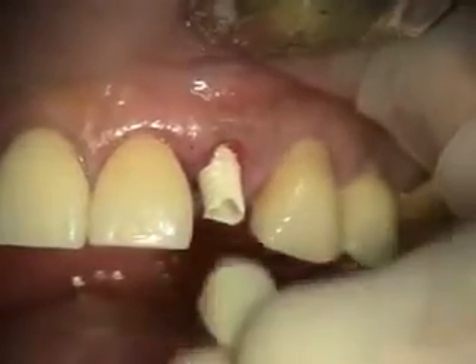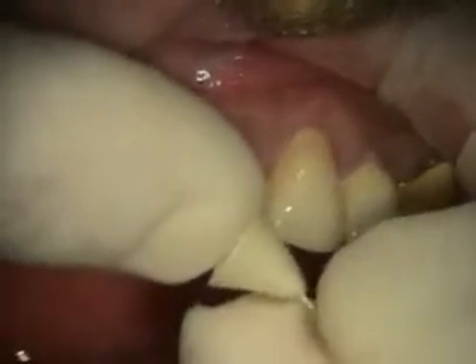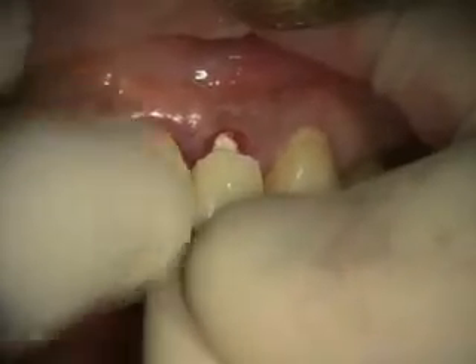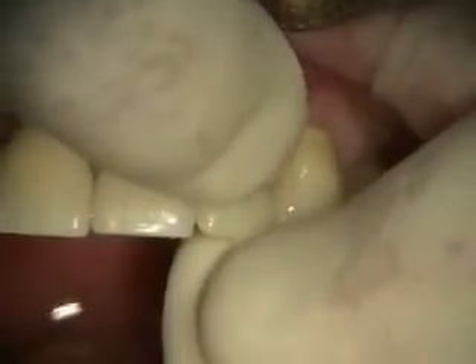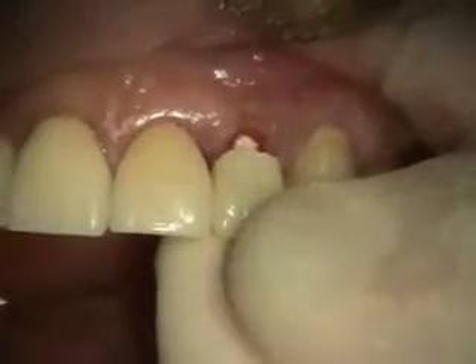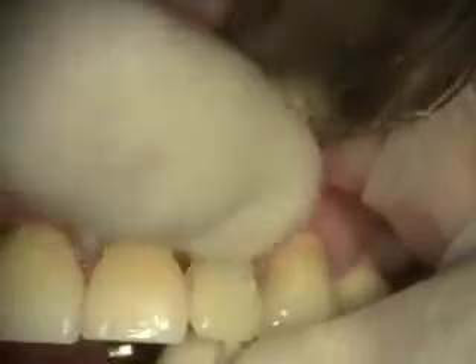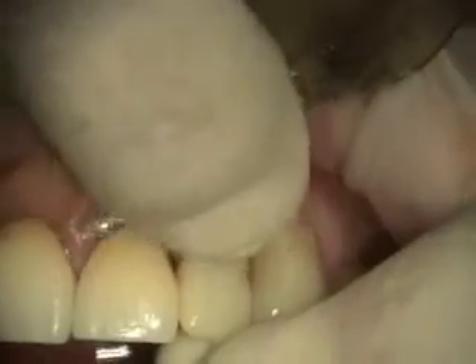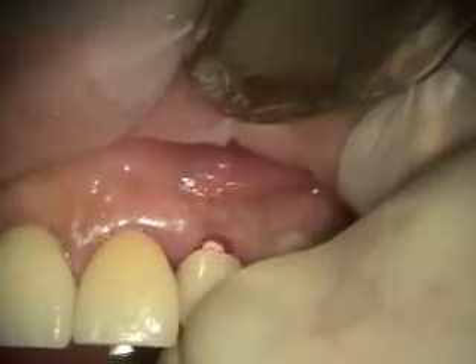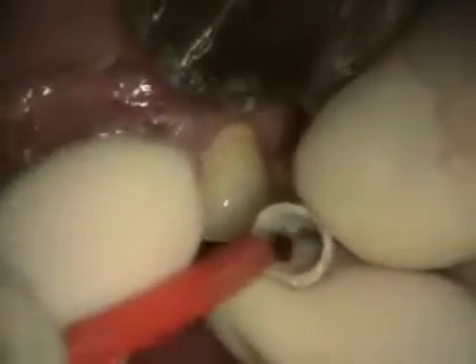We've got our abutment shaped and I trimmed our polycarbonate crown. Got the contacts checked. We're going to be straightening that incisal edge out so it looks a little more like the other lateral, but we're going to make it a little bit shorter just to keep it out of occlusion. And it allows the composite to bond.